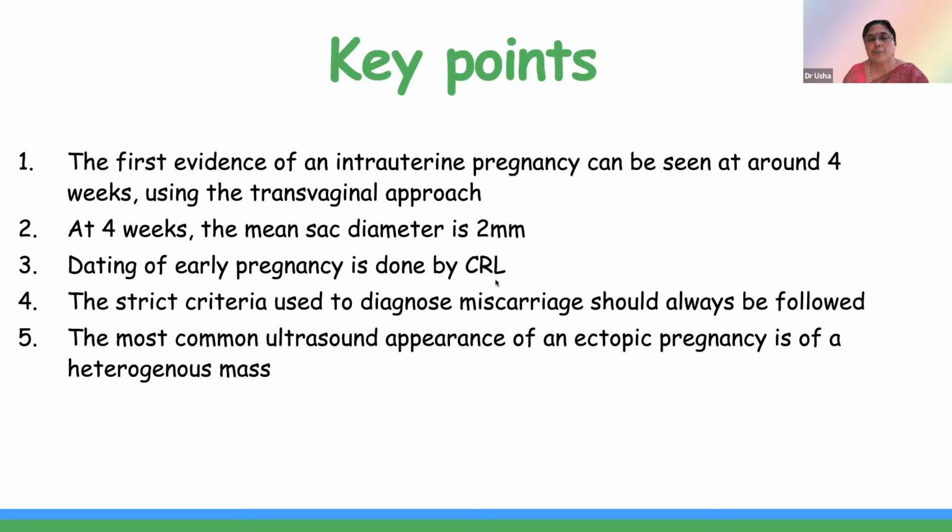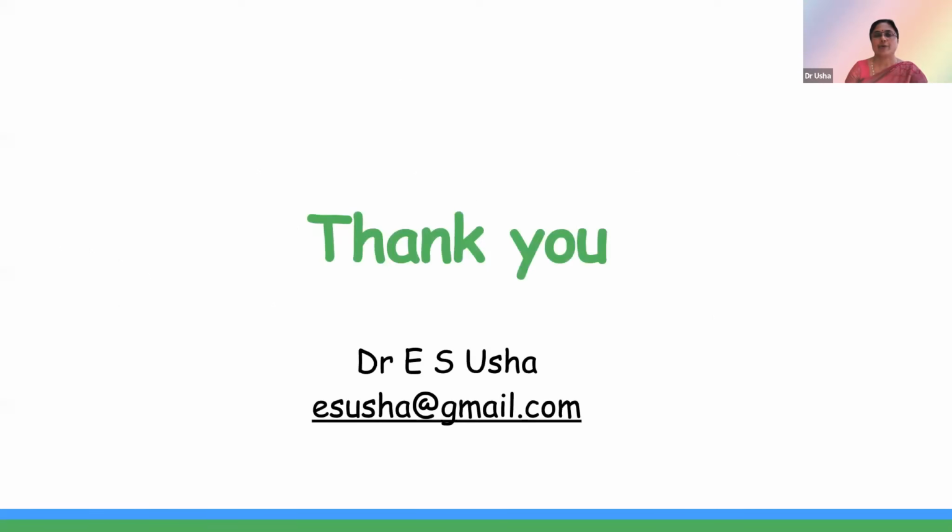And strict criteria should be used to diagnose miscarriage. And the most common ultrasound appearance of an ectopic pregnancy is that of a heterogeneous mass. So thank you.